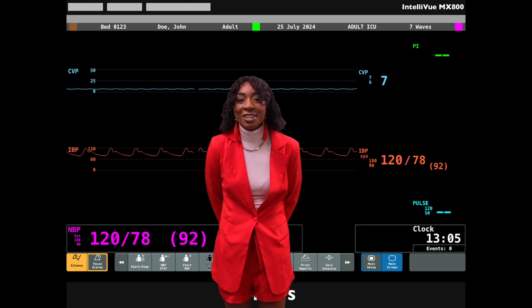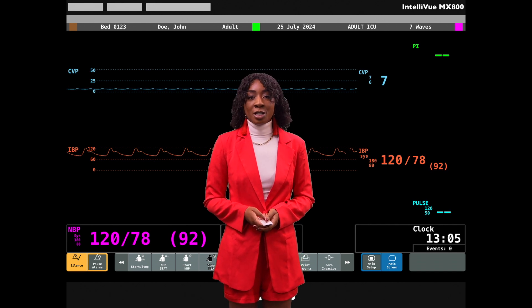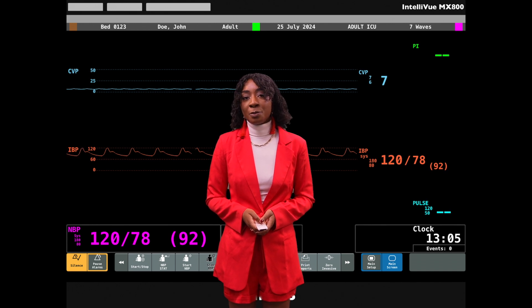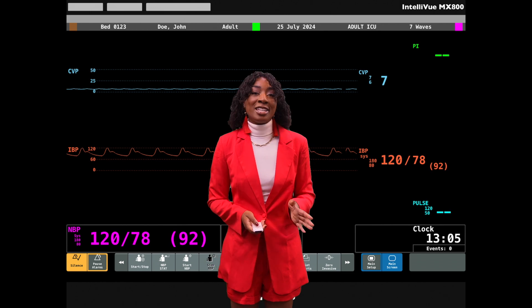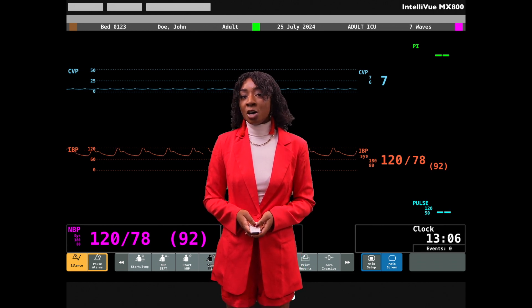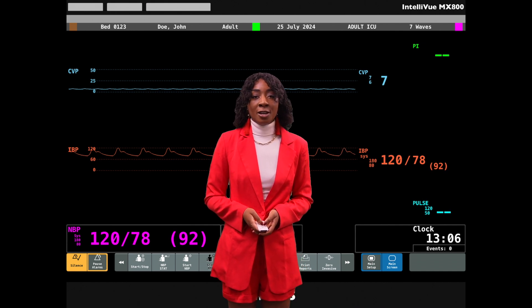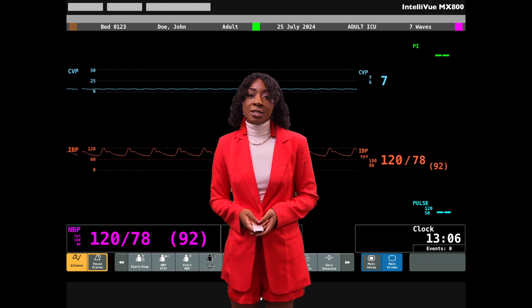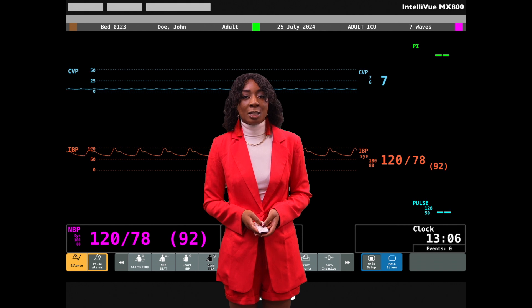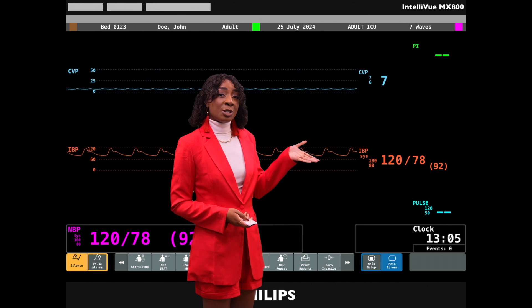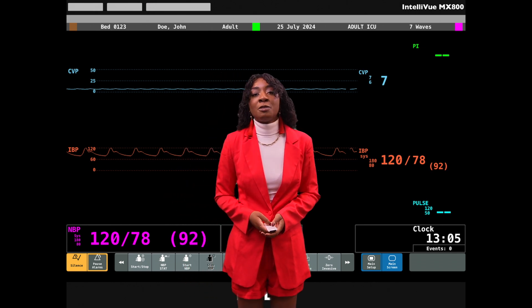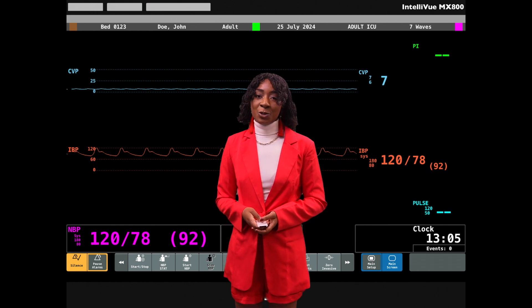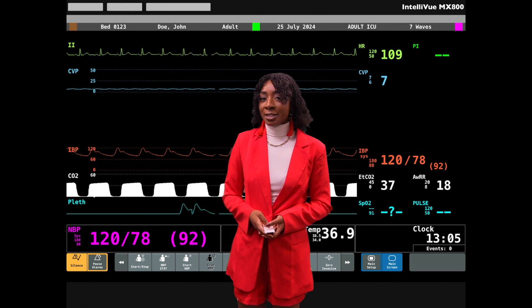For our final vital sign — arterial lines, also known as A lines, are used for real-time measurement of systolic, diastolic, and mean arterial pressures. Placing an arterial line is an invasive procedure, reserved for patients where close blood pressure monitoring is needed, such as in surgery or the critical care setting. It involves inserting a catheter directly into an artery — most often the radial artery of the wrist — and measuring blood pressure using a transducer. For accurate measurements, the transducer needs to be fixed at the level of the right atrium, and the tubing must be cleared of any air bubbles. If the patient's status does not match the A line blood pressure, check the blood pressure manually and inspect the A line equipment. A lines give standard numerical blood pressure values as well as a waveform showing the change from systolic to diastolic pressure, can provide more rapid and accurate readings than an external cuff for patients receiving vasoactive drugs or fluids, and can also be used to draw arterial blood gas samples to assess acid-base status.